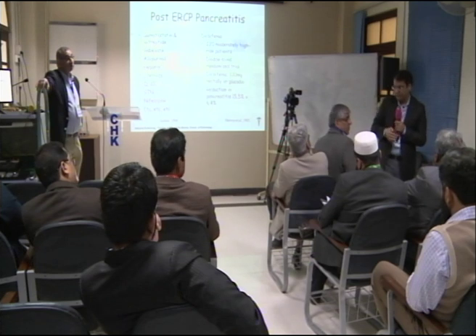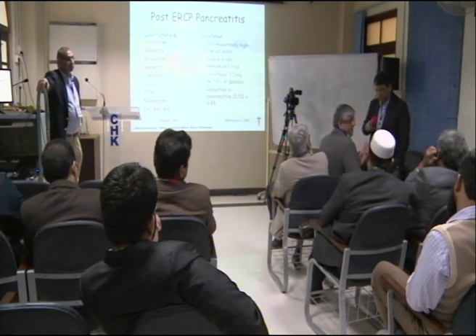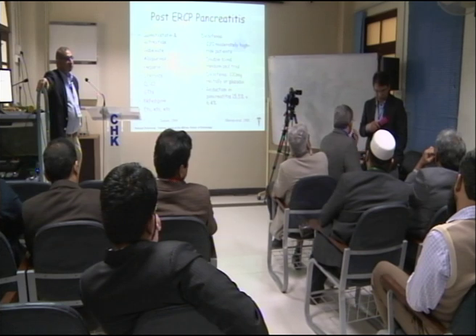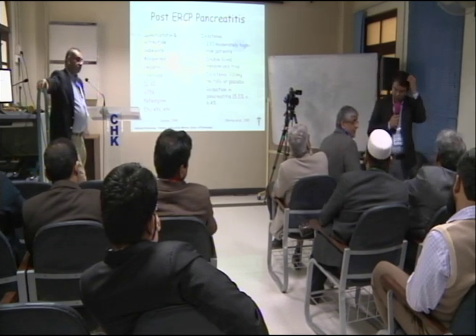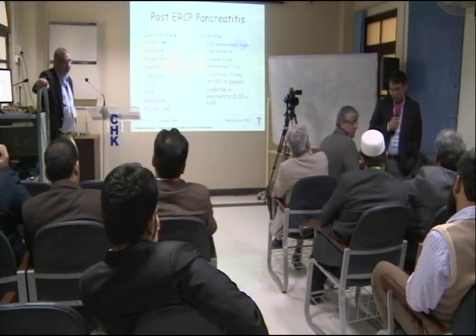Let me also add here that most centers here, I know, do not have 5 French stents. And I've seen patients being put in 7 French stents, which is too big. It's really too big. 3 French, if it's available, but most centers don't have 3 French. Most centers, in my opinion, don't even have single pigtail 5 French. So if you're going to put pancreatic stents, it's better to leave it, unless you're sure that you have the right stents with you.